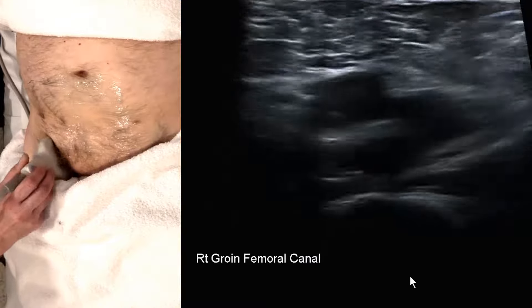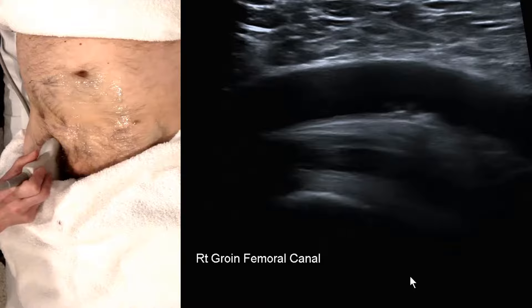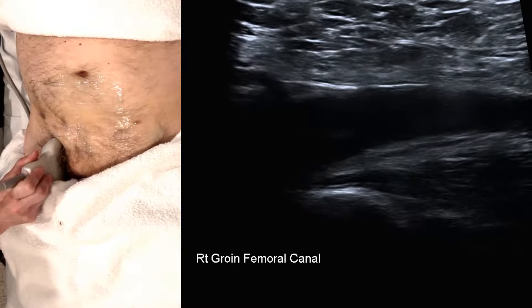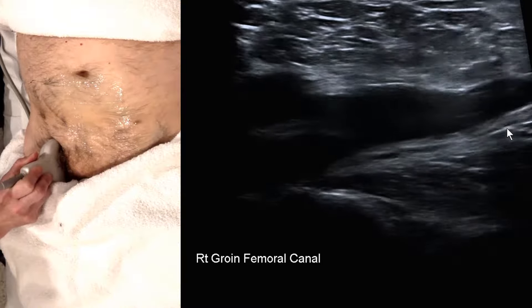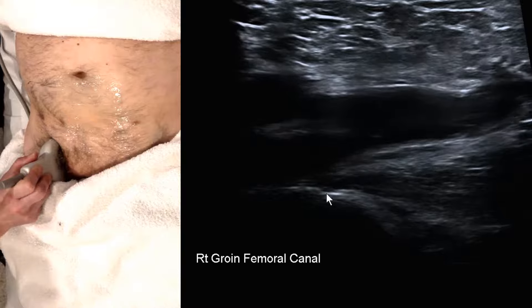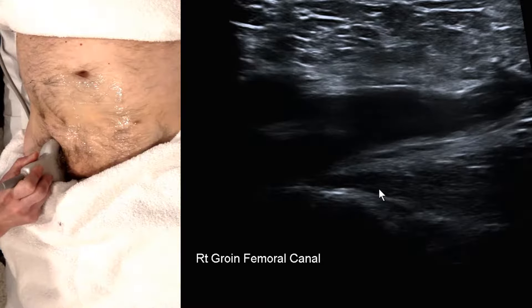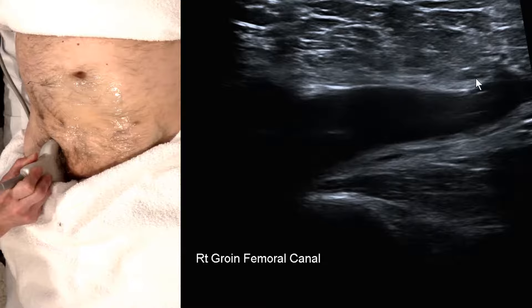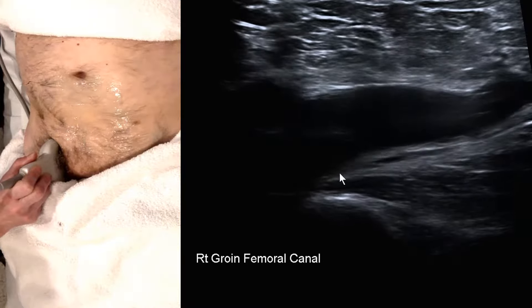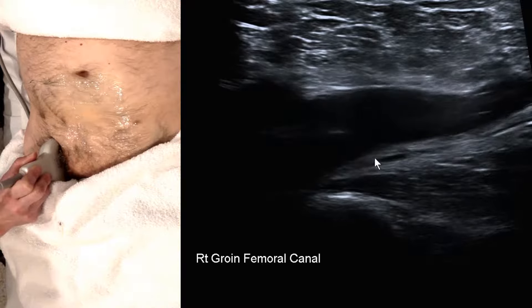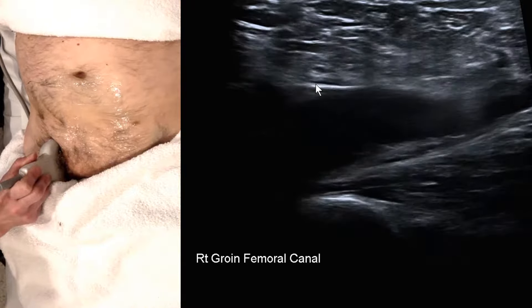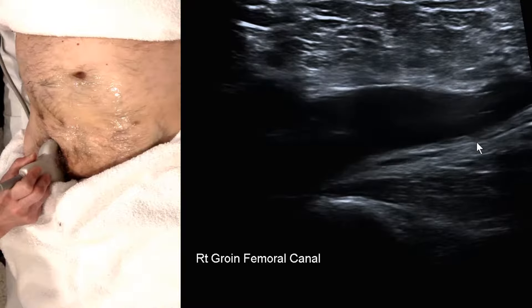In longitudinal, we find the femoral artery, move medially to find the common femoral vein, then oblique the lower end of the transducer to identify the SFJ. The pectineus is seen behind as a sort of triangular muscle. This anterior margin of the pectineus is where we look for our femoral canal. We don't want too much of the vein in the picture, but the inguinal ligament is the landmark below which any movement is significant.